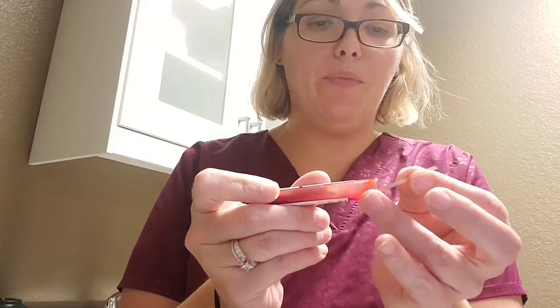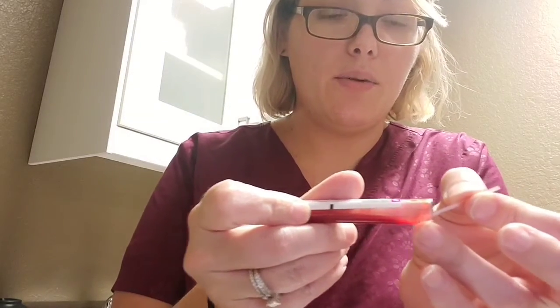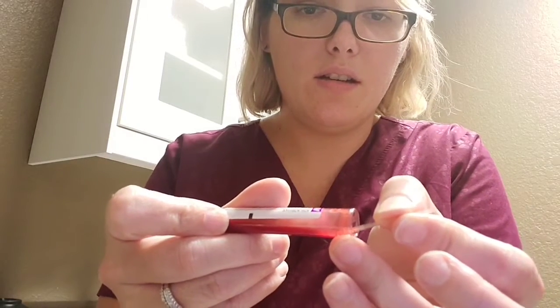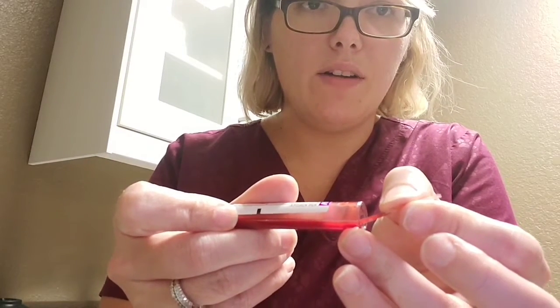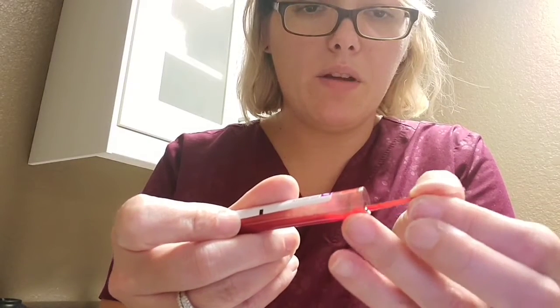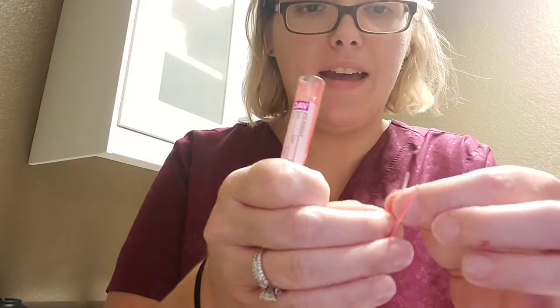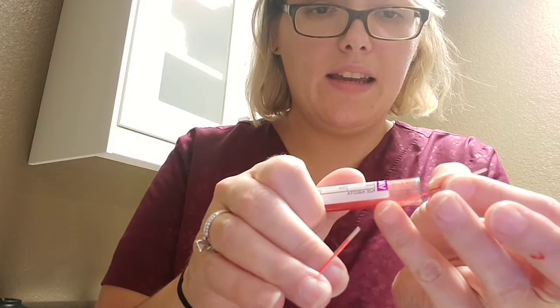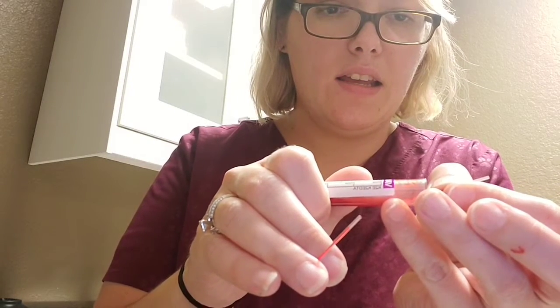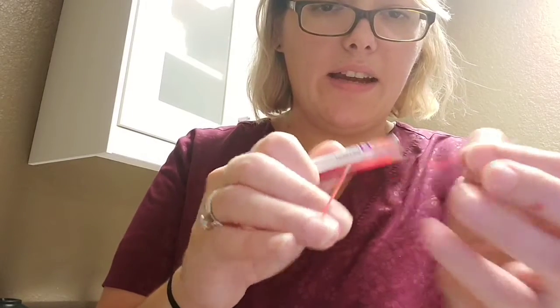So first things first is filling up our microhematocrit tubes, same way as we would if we were doing a PCV. I think you should be able to see what I'm doing here. Alright, we're filling up. And I do want to go about 3/4 of the way. In one I got a little bit higher than that, so I'm going to do the other one and see if I can level it out a little bit more.